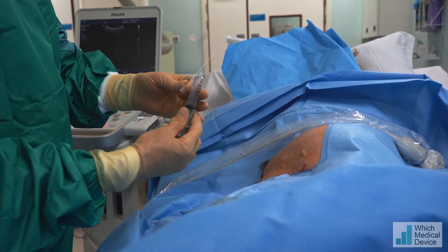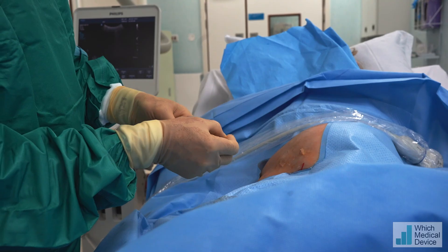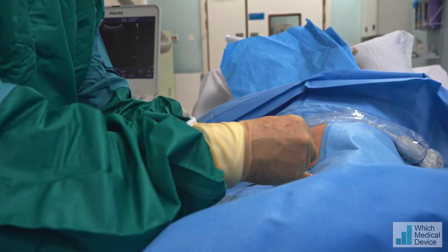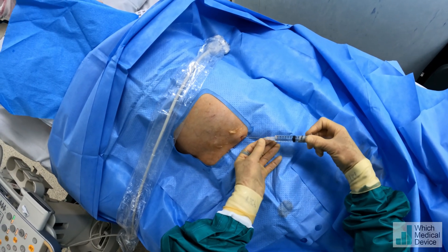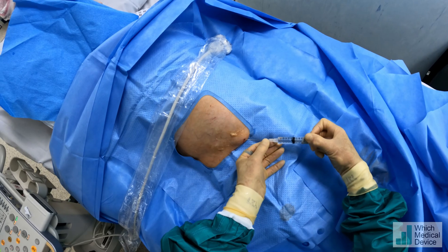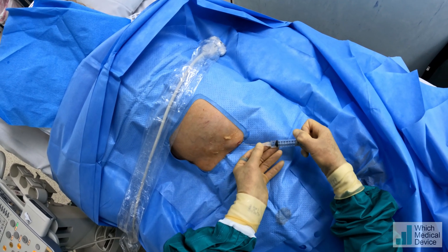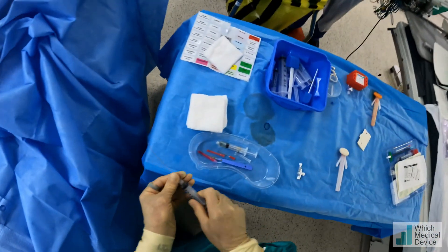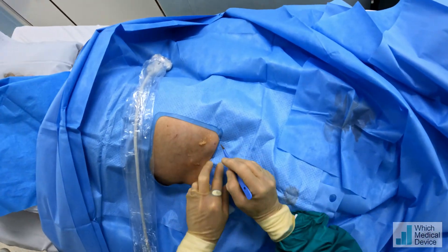Now I'm going to take a spinal needle and go under the skin to anaesthetise the track. I'm just going to very carefully bend this so I can steer it. More anaesthetic now — we're just going to steer this along up towards our exit site. Then we're going to come all the way back, putting anaesthetic all the way along that track. Once we've got lots of anaesthetic in there, we're going to make a small incision at our puncture site.